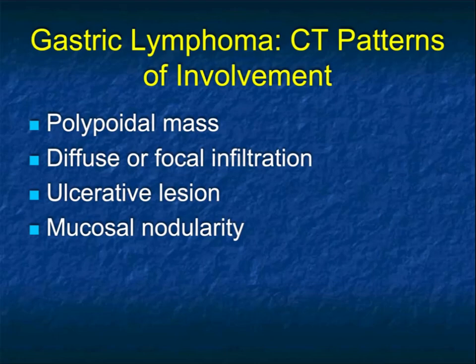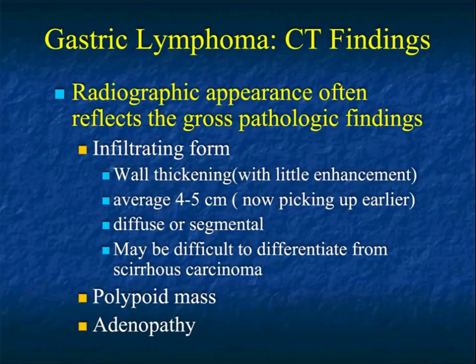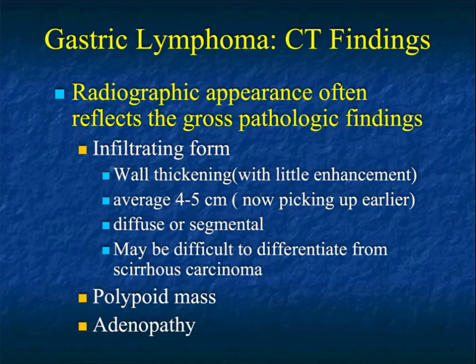When we think about gastric lymphoma, there are CT patterns from a polypoid mass to diffuse infiltration to ulcerative lesions to mucosal nodularity. In the old days, we used to separate gastric adenocarcinoma from lymphoma by saying that if a mass was over 5 cm it was lymphoma. But now with CT, we pick up things much earlier, and the overlap — particularly early — between lymphoma and gastric adenocarcinoma is high.